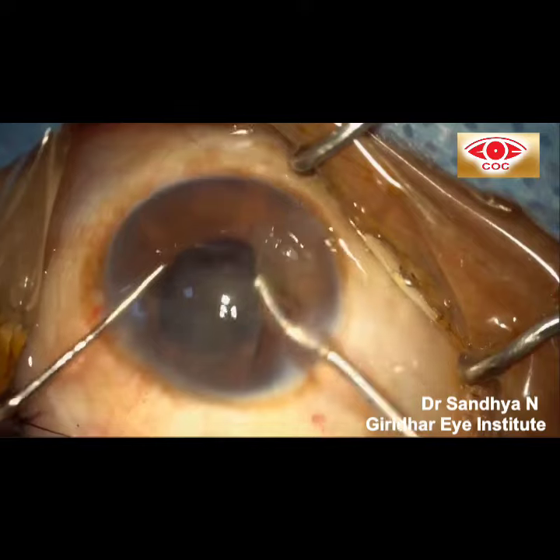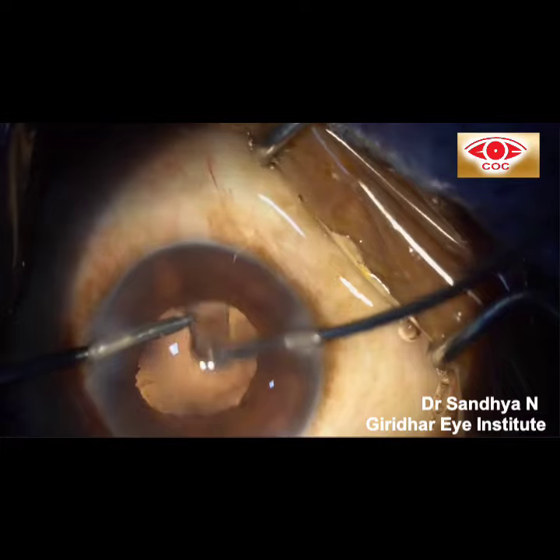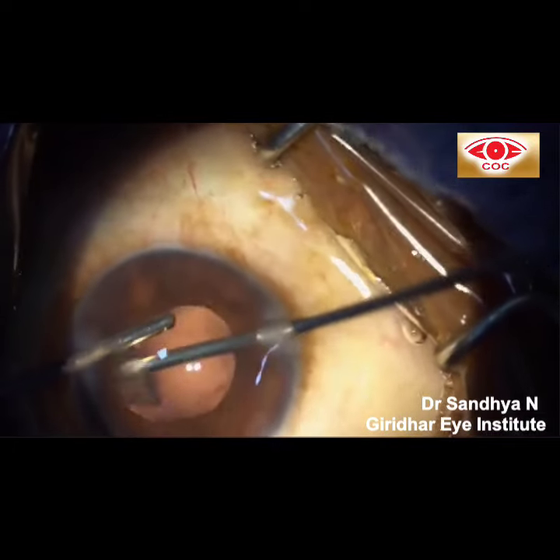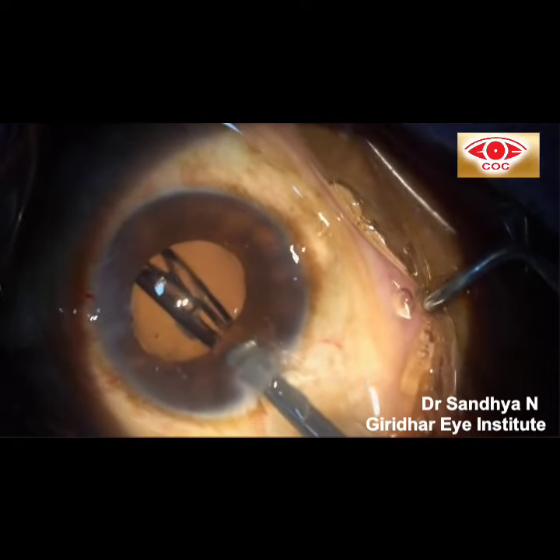Emulsification of nuclear pieces was carried out in the supracapsular plane so that the fluid waves do not pass under the iris and lift it up. Cortex aspiration was also done using low parameters. The capsular bag was filled with OVD and a single-piece foldable acrylic IOL was placed inside the bag.